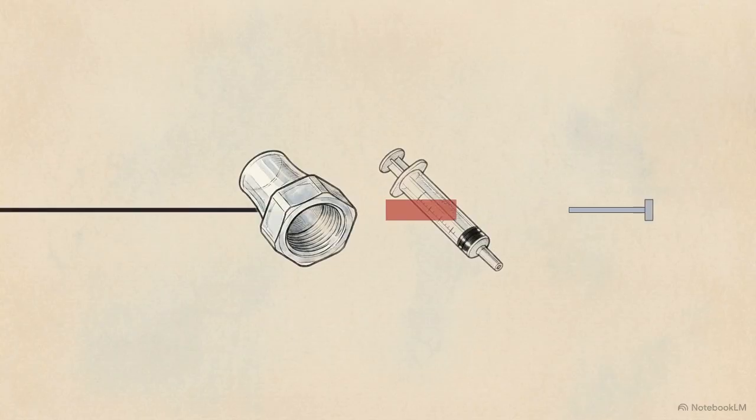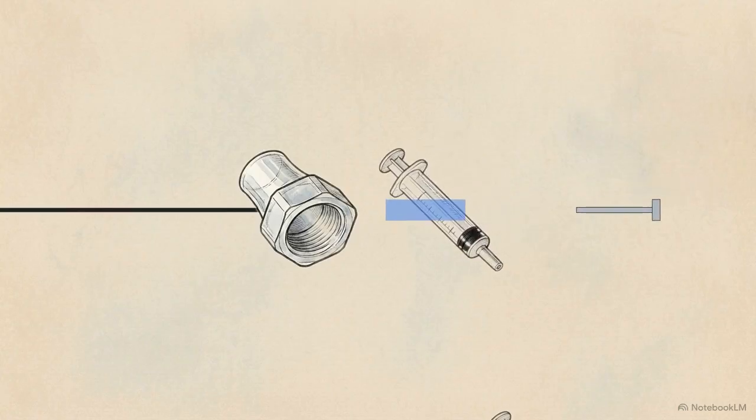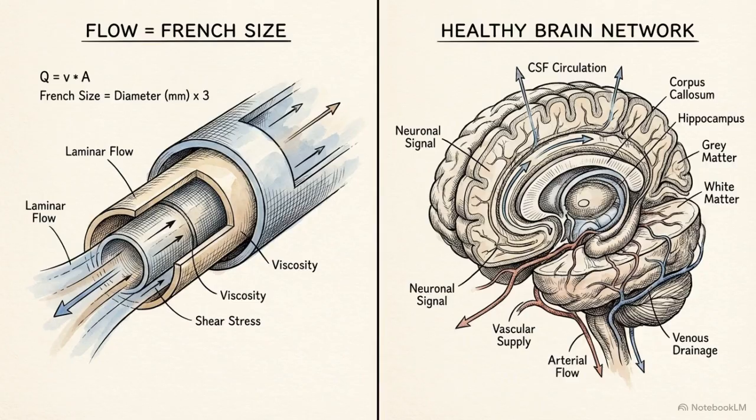The operator aspirates until blood clears the catheter, but then that syringe is discarded entirely. A brand new, sterile, air-free saline syringe is attached for the actual flush. Strict adherence to flow equations prevents the system from rupturing under pressure, while double flush protocols guarantee that 0 lethal artifacts are introduced into the neurovasculature.